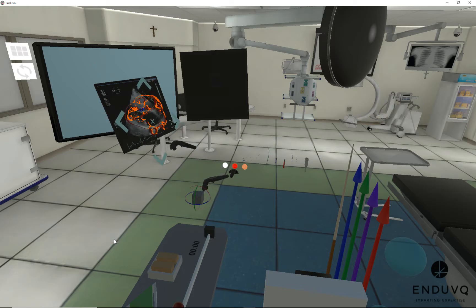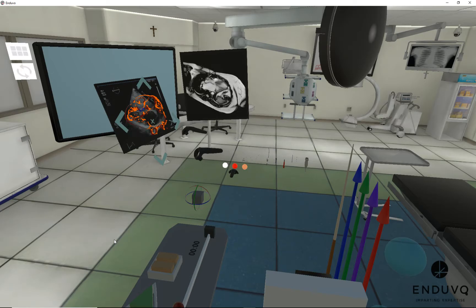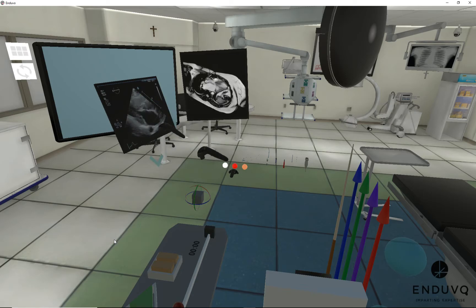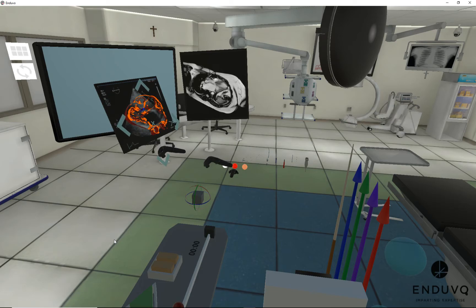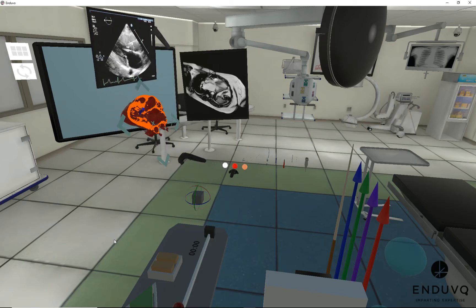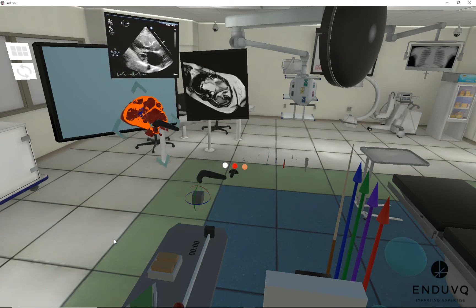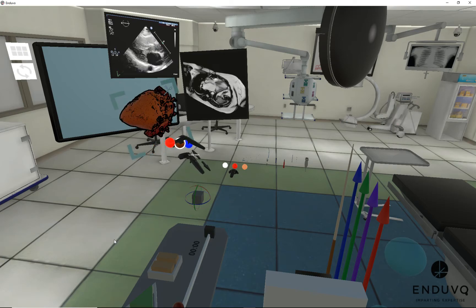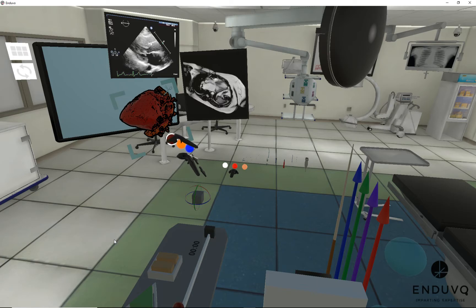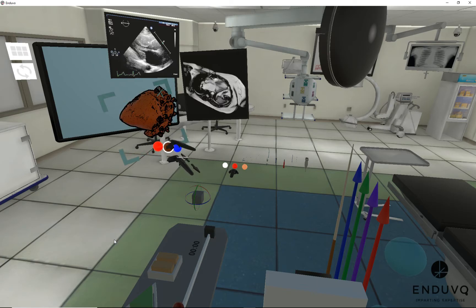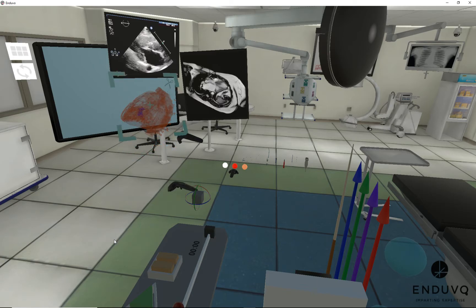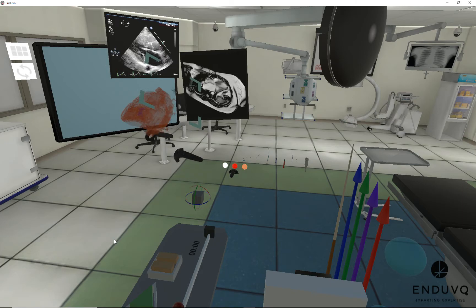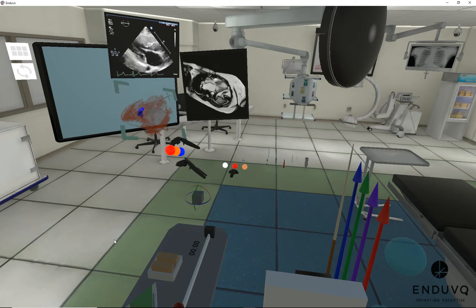And so what we have here is an example of a patient with hypertrophic cardiomyopathy. You can see how I have the model overlaid here with one of the MRI images. In this model, we have the region of hypertrophy highlighted. I can go in and show you can see the segment that needs to be excised to relieve the obstruction in this model.